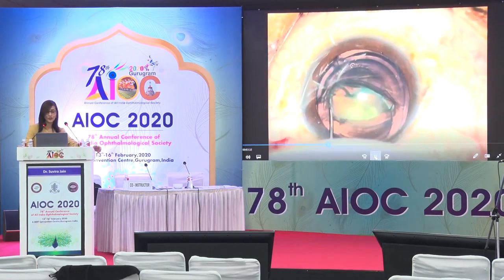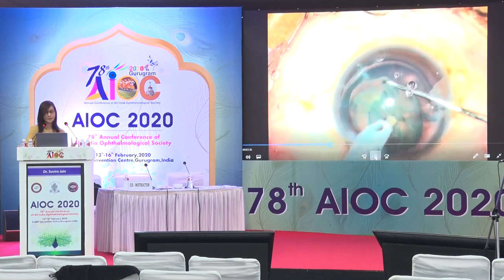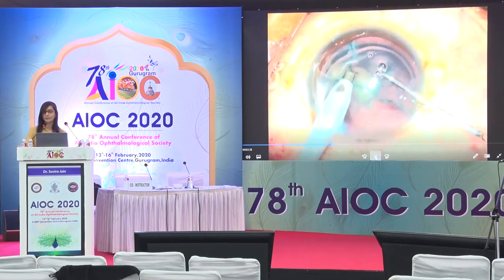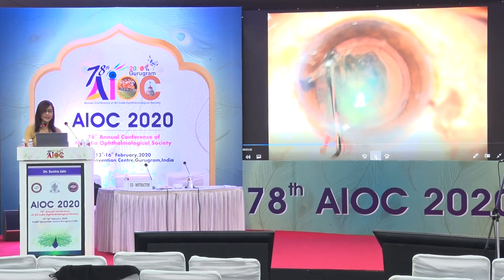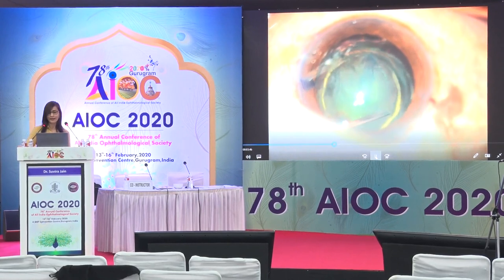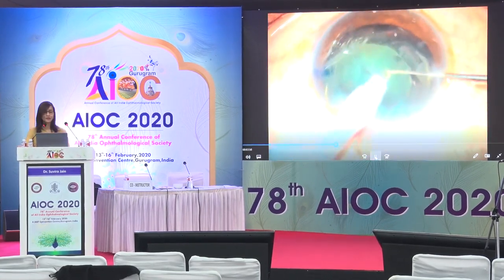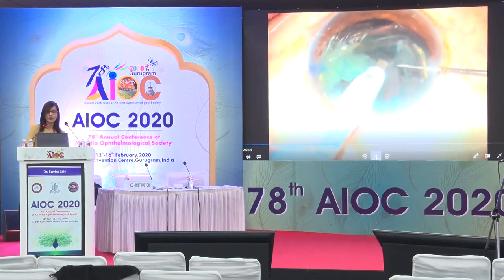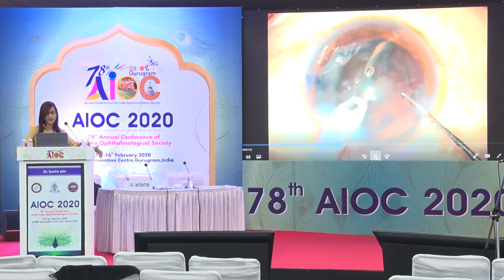Here is another case. After hydro delineation, the nucleus pops up — if it pops up, you take advantage and go ahead and aspirate the cataract. As cataracts get a little denser, having delineated the endonucleus, you lift it up and do a tilt and chop — you hold it and keep chopping, after which the epinucleus is removed.